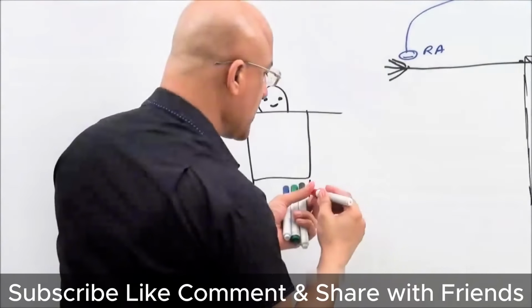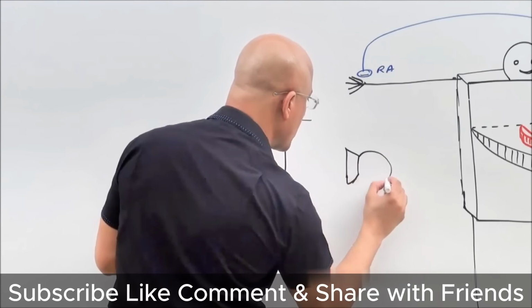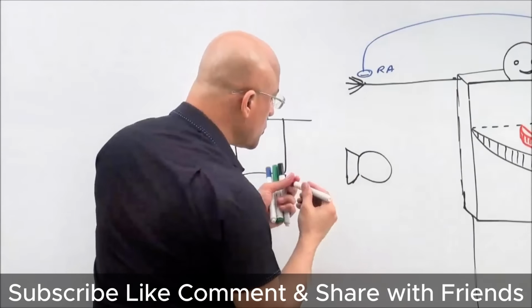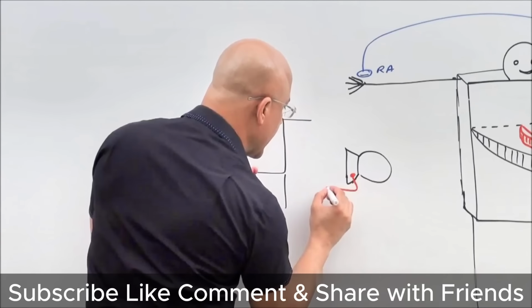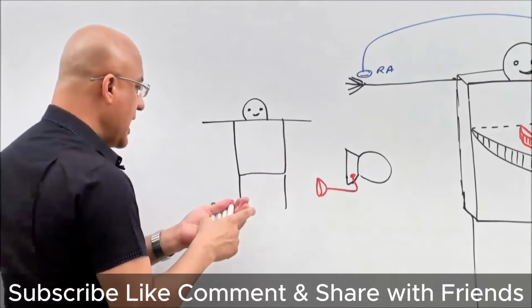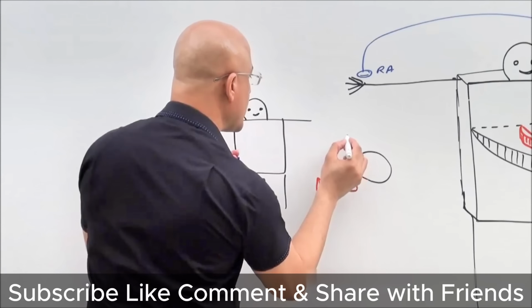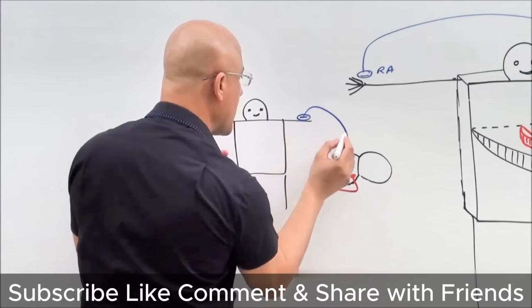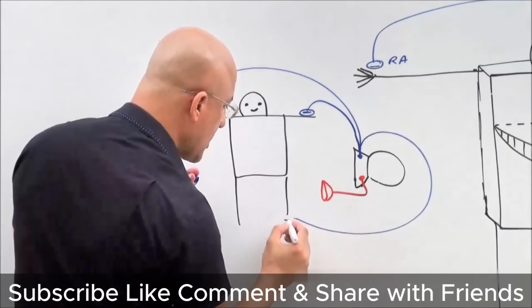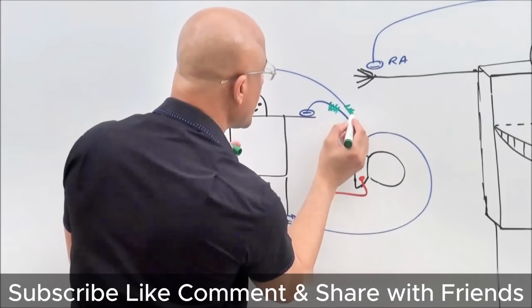What was Wilson's? When we construct a unipolar lead, I'm not talking about chest leads now, generally speaking, a unipolar lead, right? In a unipolar lead, the positive terminal is attached to the exploring electrode, and the negative terminal is attached to a common terminal. Here it is attached with the left arm, then it can be attached with the right arm, and it can also be attached with the left leg. Is that right? And everywhere there is high resistance.